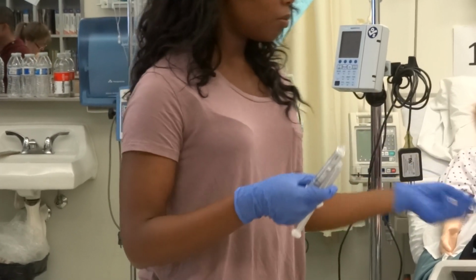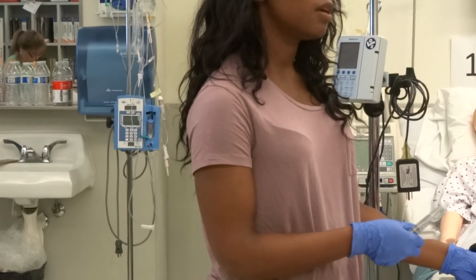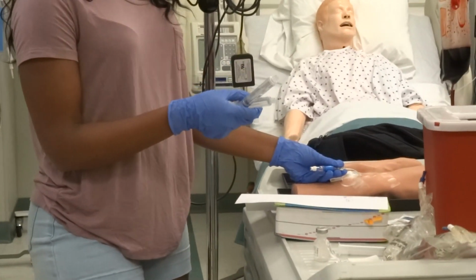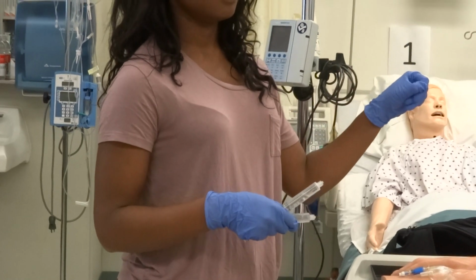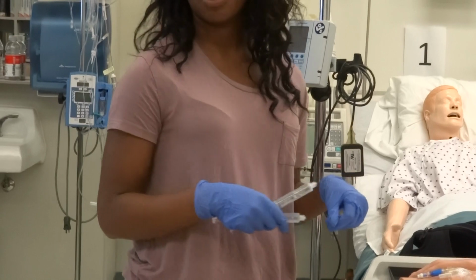When I come into the room and I assess the IV, I'm making sure that it is patent. Before I push the medication, obviously scrub all that. Then I can take off the needle and put it inside of the sharps next to the patient's bed, and then give the medication over 2 minutes.